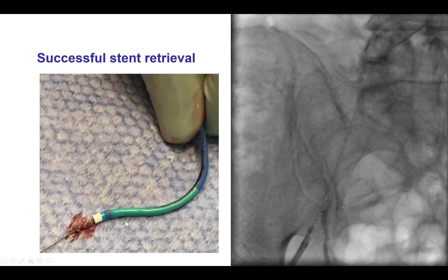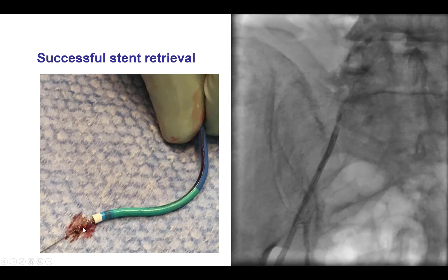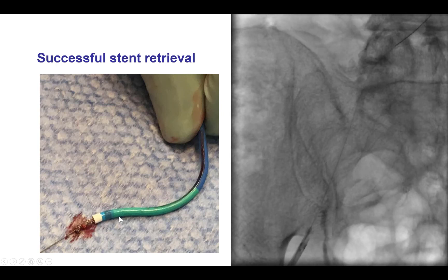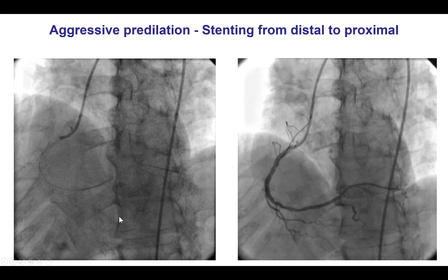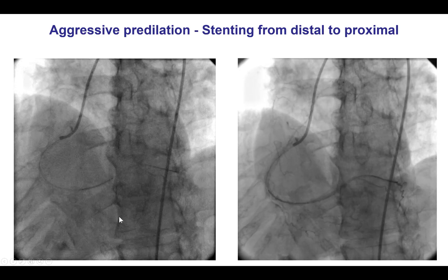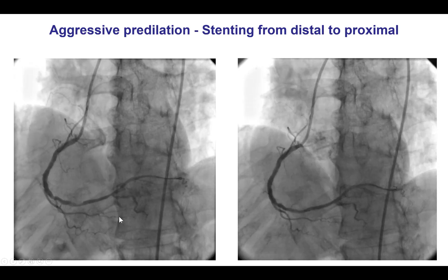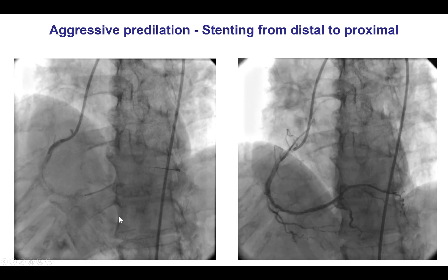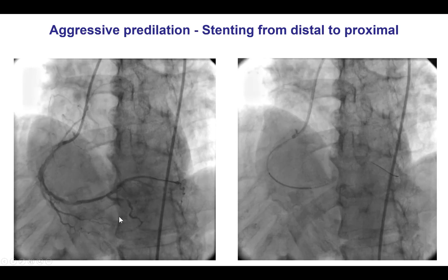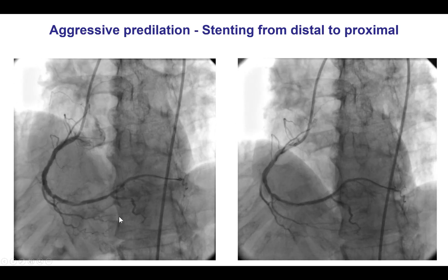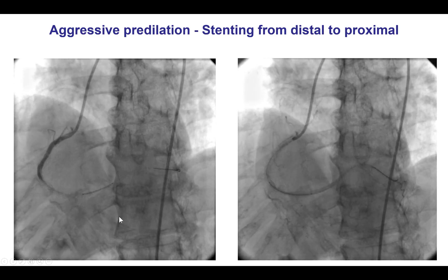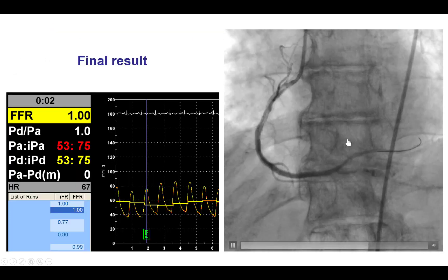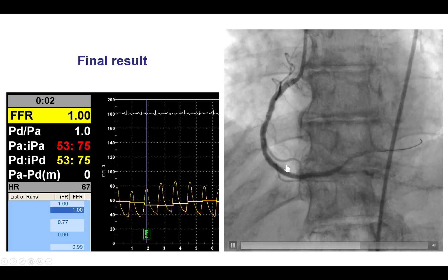This is how it looked: the guiding catheter with the stent partially outside the guide catheter and partially inside. The most likely cause for this was that we did not prepare the vessel well. Therefore, after having gone through this process, we performed multiple high-pressure balloon inflations to prepare the vessel.